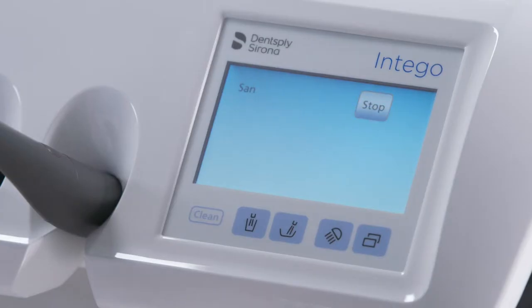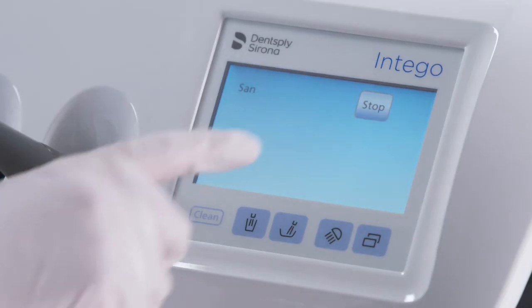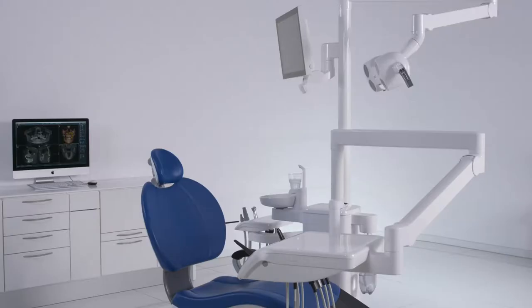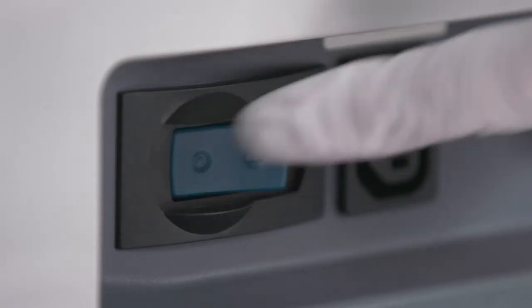After flushing the last instrument, press the flashing orange stop button on the EasyTouch. The sanitation process is now finished and your treatment center is again ready for operation.